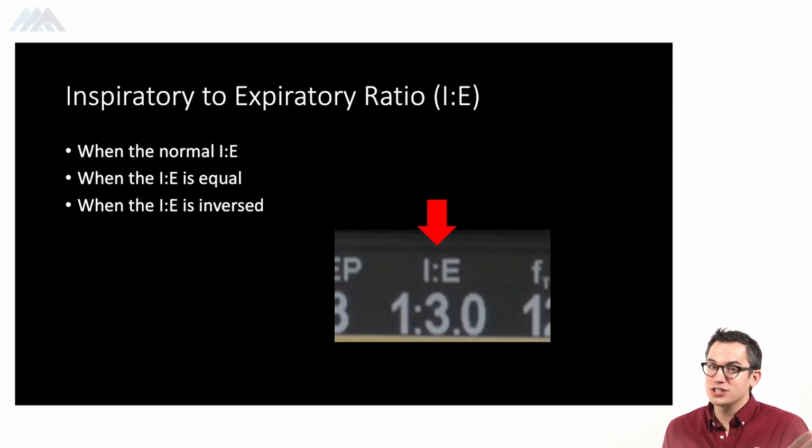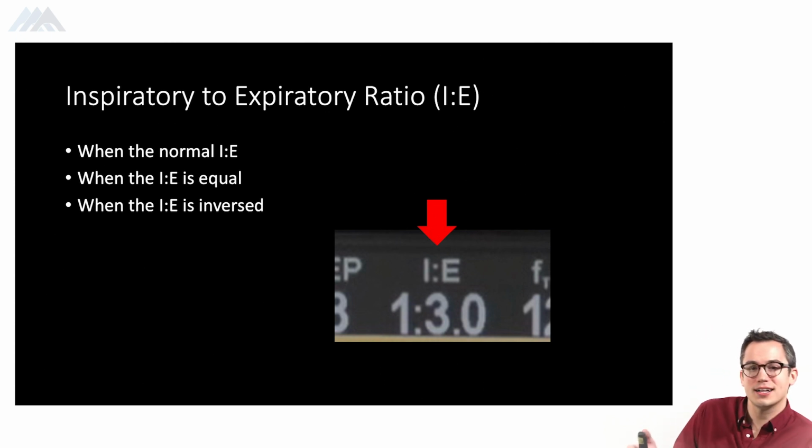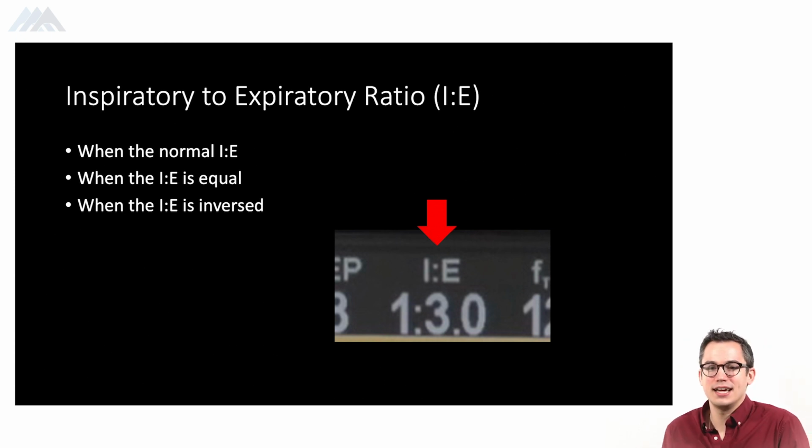But we're also watching out, again, we're decreasing that expiratory time, so what's that going to do? Really be increasing our patient's CO2. But that's where we walk the balance of how we are going to manipulate this ventilator to the specific needs of the patient. And in my practice, when we inverse that I to E ratio is for our patients who are in ARDS.